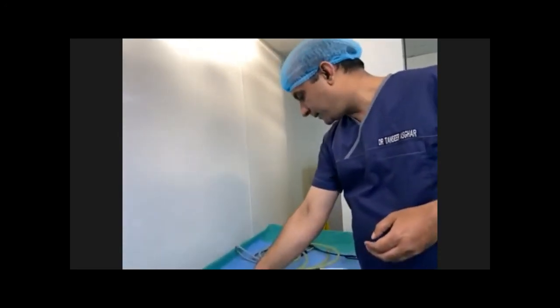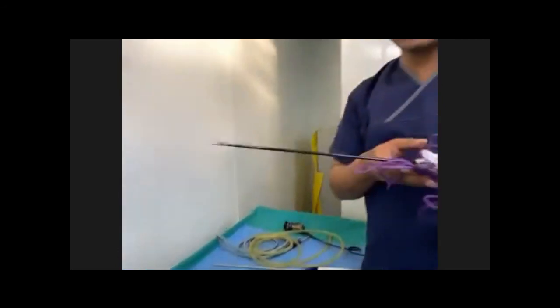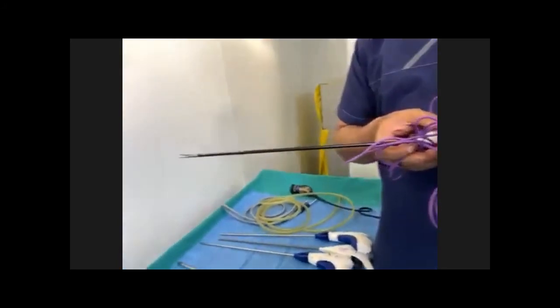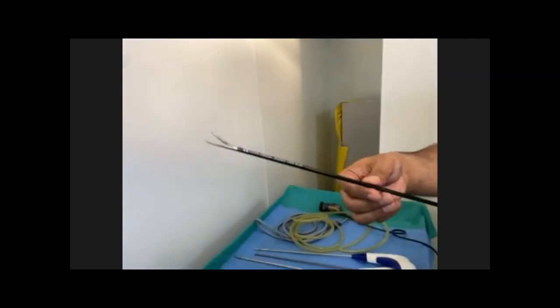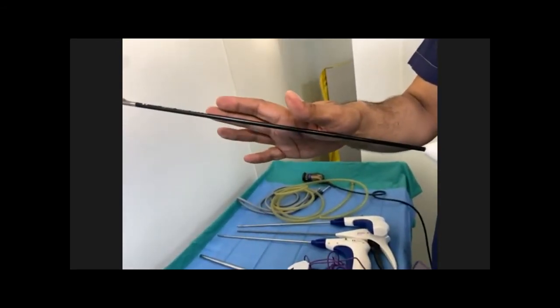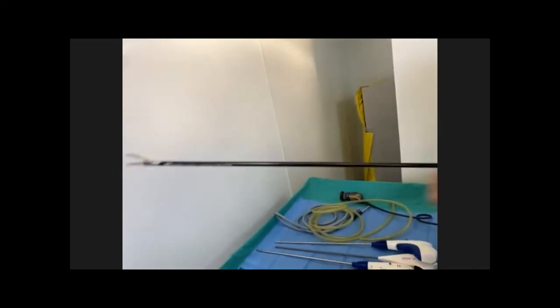Right? So these are some more important instruments usually used in advanced laparoscopy, but these days they are used in basic laparoscopy as well. For example, this is a LigaSure. LigaSure is an advanced bipolar technology gadget, which we use for ligating the vessels and cutting them. So it has a shaft. It is attached to the LigaSure base unit. The length of this shaft is 37 centimeters and the diameter is 5 mm. But we can also have this LigaSure in 10 mm and 37 centimeters. And it has a Maryland tip, endodissect tip. This is the specialty of this one, but it also has a dolphin tip.